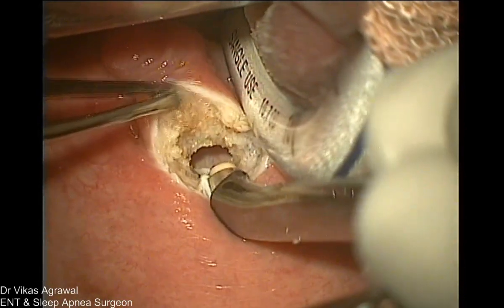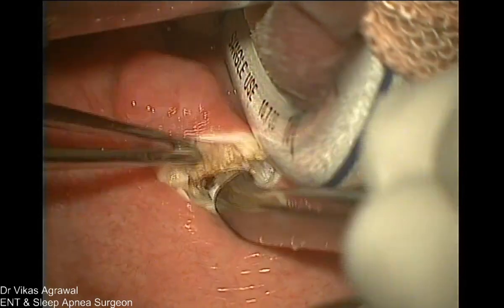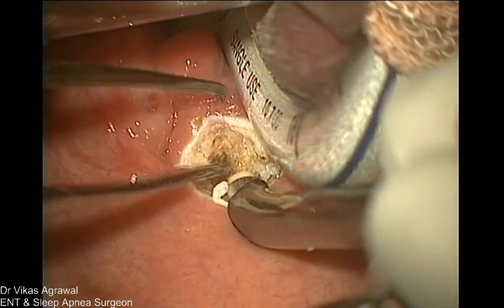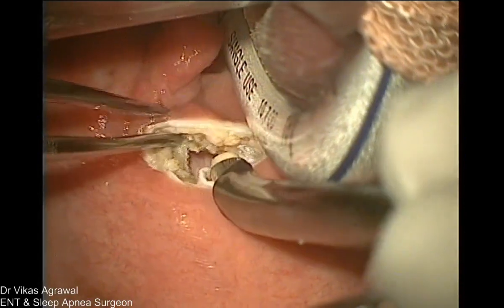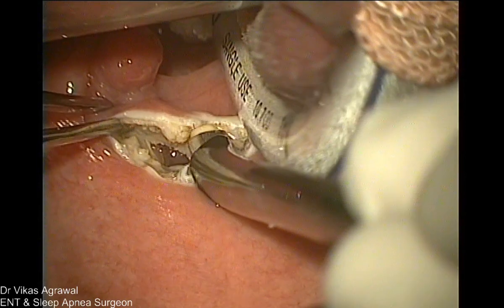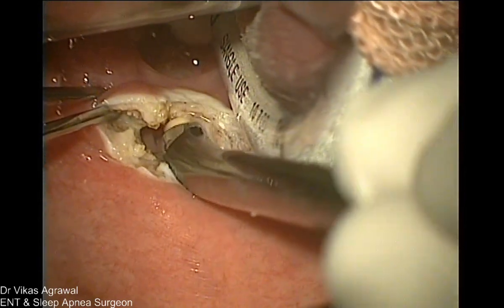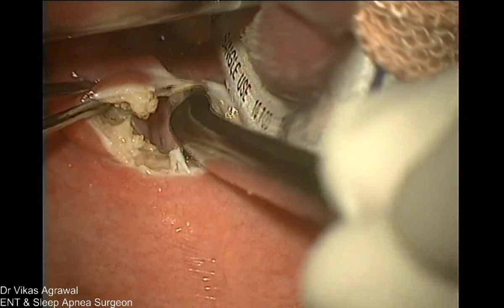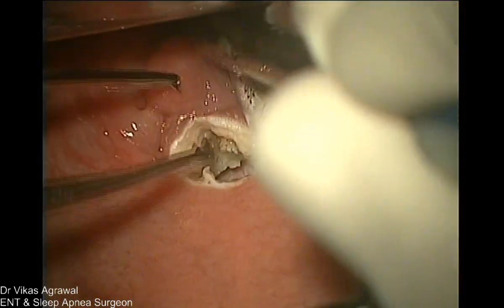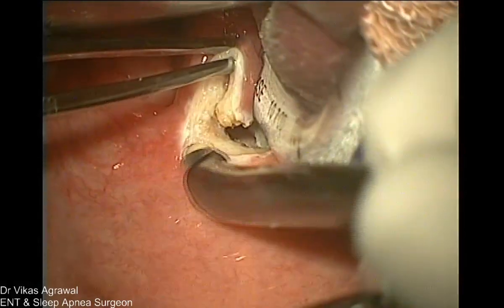So now you see the musculus uvulae is completely gone. If you wanted to suture, you could have preserved this mucosa and sutured it like that. I am not a great fan of suturing because sutures give the maximum problems in the post-op period. So I am just cutting it here so that I can take the tissues on the left side first.